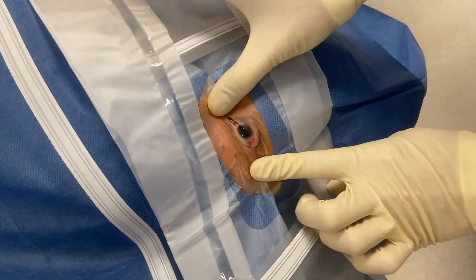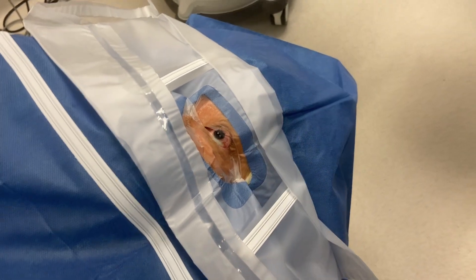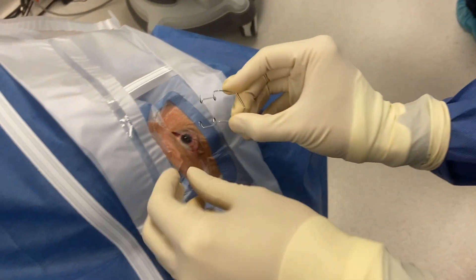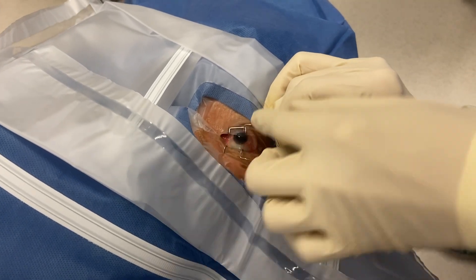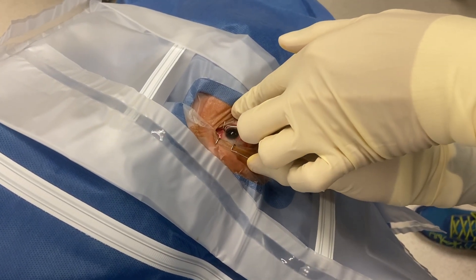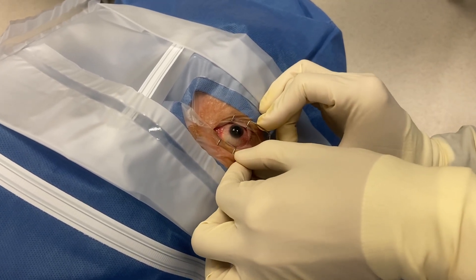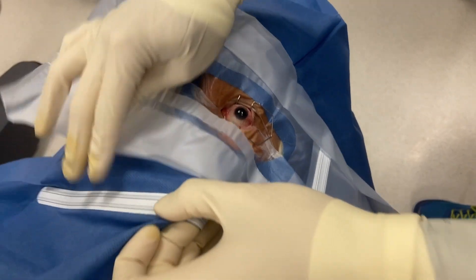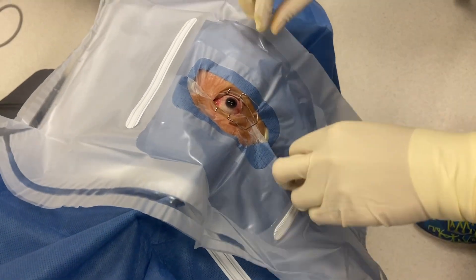And there you are. Put this one in with a little bit of overlap on the upper and lower eyelid. We're also able to cover the meibomian glands, which helps prevent sebum secretion during surgery from obscuring the tear film.